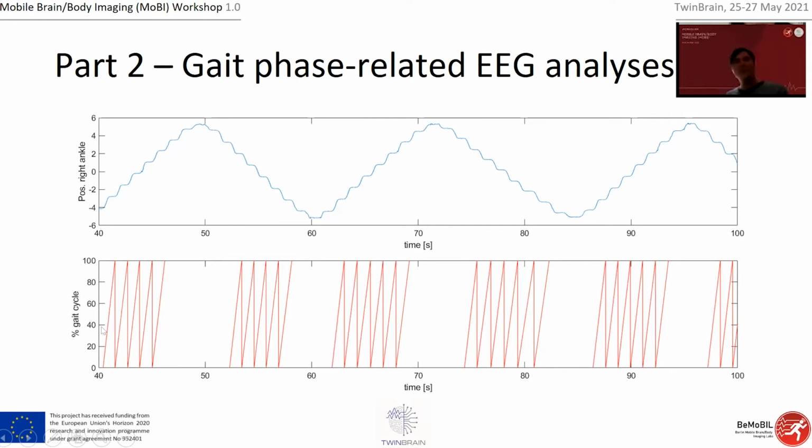They can vary in length, meaning the steepness of those traces can vary, and that is a rough indicator of how fast you're moving. If you have different step lengths, these gait cycle periods can be longer or shorter.